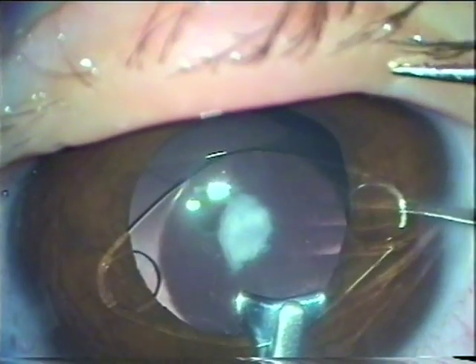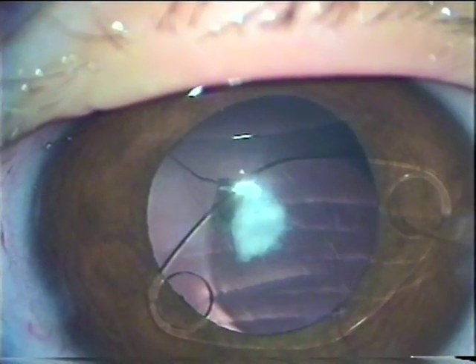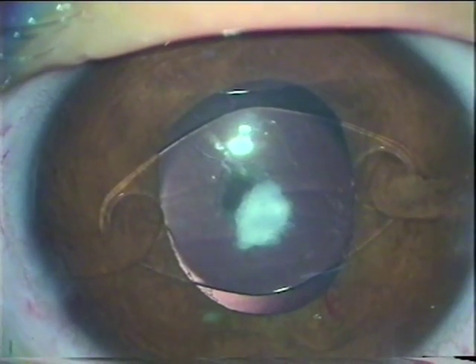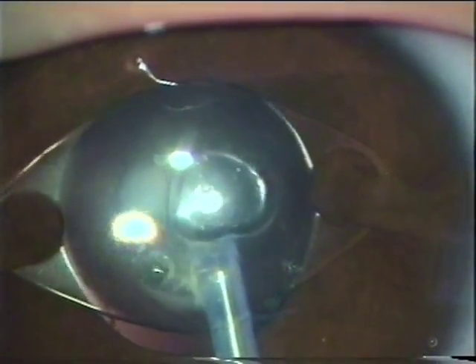An IOL is inserted through the pocket incision and fixed into place. Now we go after the Hyaloid Artery.